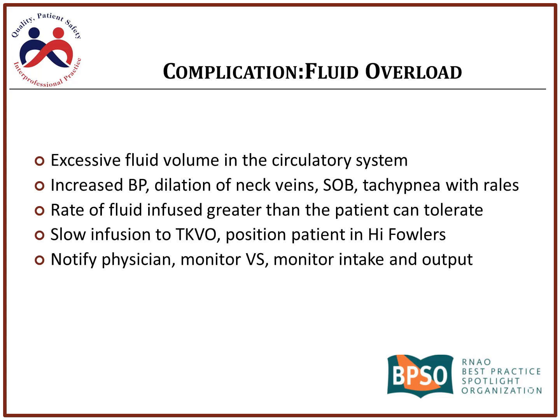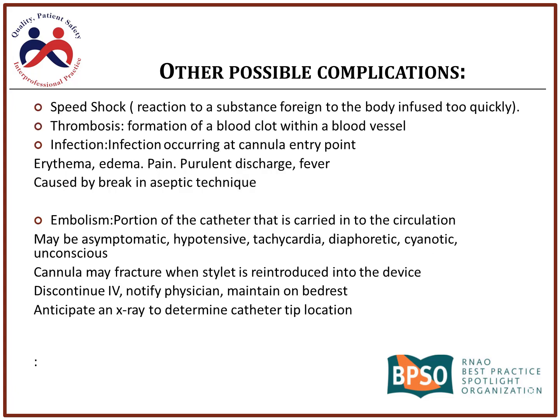Fluid overload, so I have the symptoms here. You're going to see increased blood pressure, dilation of neck veins, shortness of breath, tachypnea. So what's happening there is the patient just can't tolerate the volume, and that's one of the things I mentioned, like you have to know the patient before you're starting the IV therapy. A CHF patient would be at very high risk for fluid overload. Speed shock, so again, that's where you give a foreign substance and it's infused too quickly. Thrombosis, the formation of a blood clot within a blood vessel.